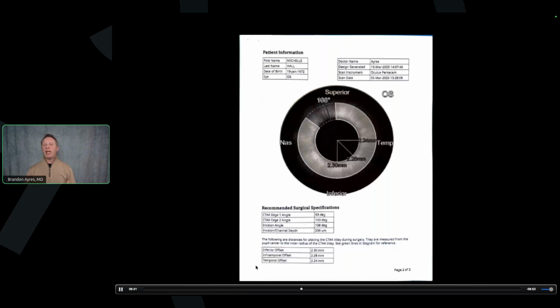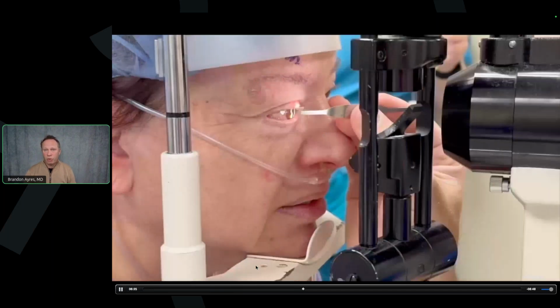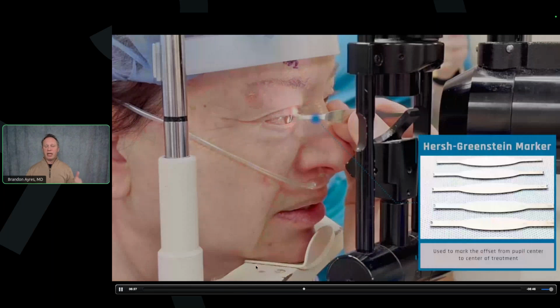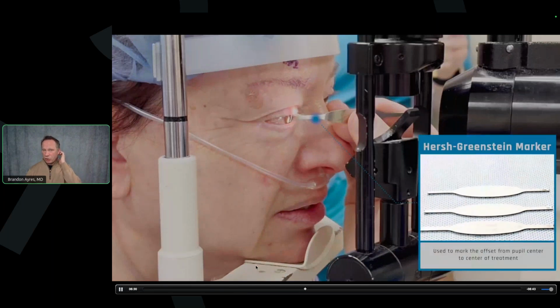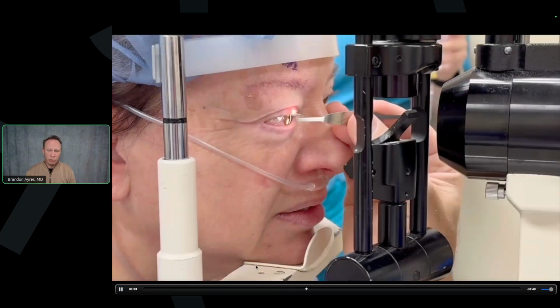The segment is irradiated cornea and it comes packed in albumin. All right, so it's actually good on the shelf for several weeks. So I've had a case where a patient had to cancel due to elevated blood pressure. The cornea doesn't go bad. I just held it in the surgery center for him until he was ready to go.